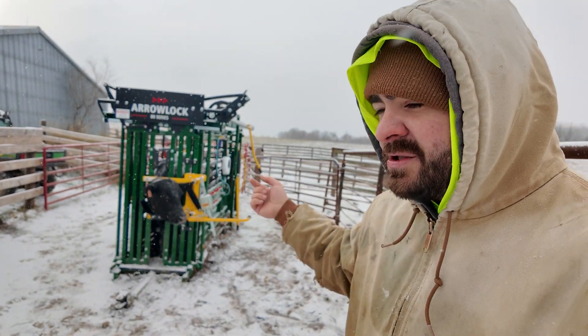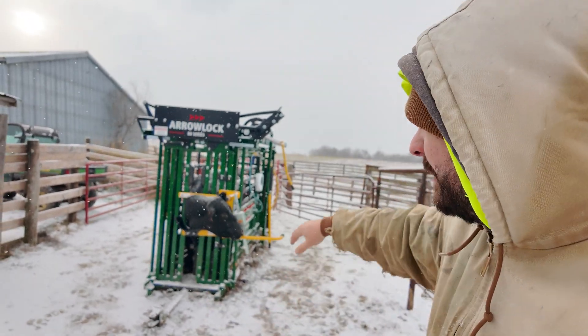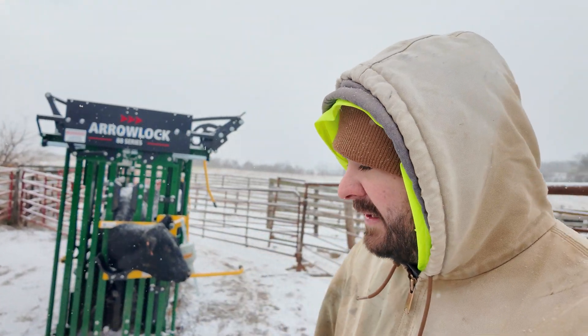What I've been doing is running the cows into the chute and closing the back gate on them as they run in. The bars on the front of the chute let light through, so the cows are not hesitant to run into it. By the time they run up to the front and figure out it's not open and start backing up, I can close the gate on them in no time.